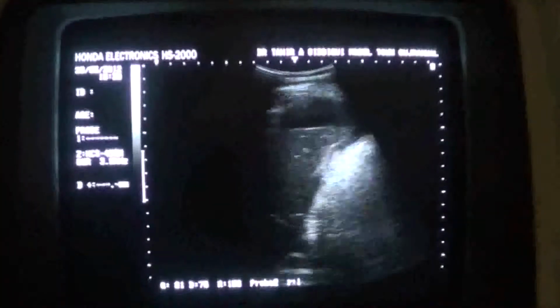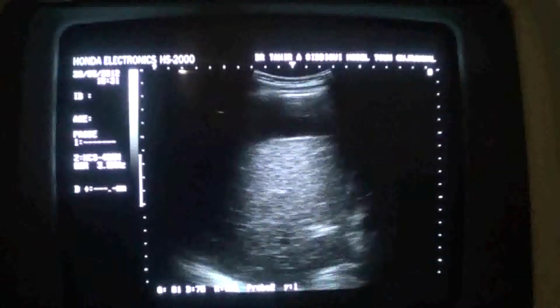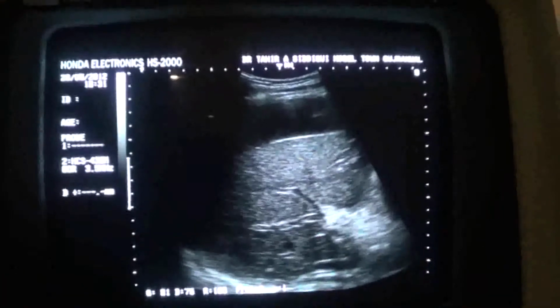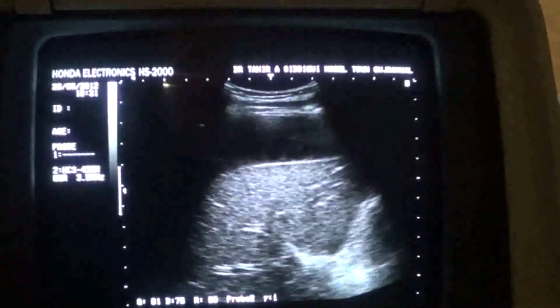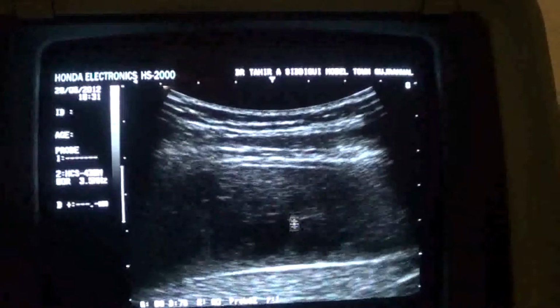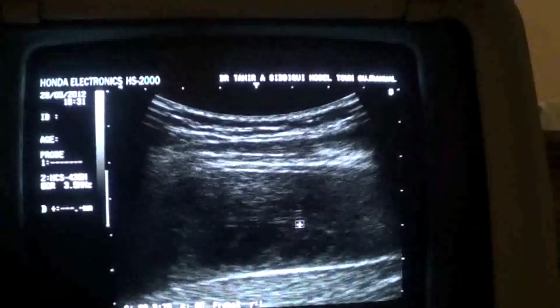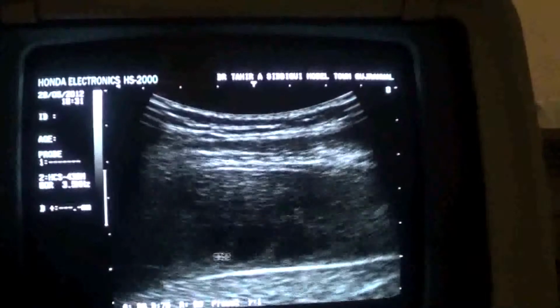Now you see, this is the liver. The liver is absolutely normal. So far there is no tear or breach seen. The vessels, the portal vein and its branches, these are the anterior and posterior branches from the right portal vein. The liver outer surface is smooth, and if you concentrate on this region, you will see floating echoes in this fluid that is surrounding the outer surface of the liver. These are floating echogenic areas.